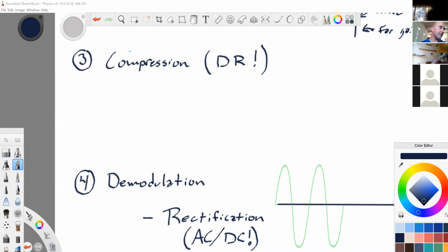So this is adjustable. When we do it, it modifies the grayscale mapping. When they say grayscale mapping, they basically say, if I don't compress at all, the map has the most echogenic over here to the most hypoechoic, and there's a whole variety of shades of gray in between. And then when I squeeze it down, I'm squeezing down the map, basically.